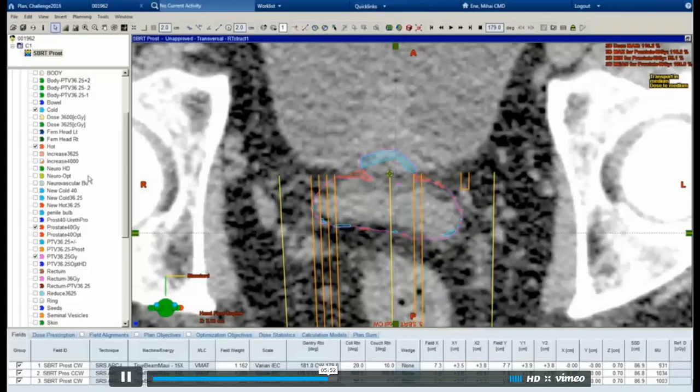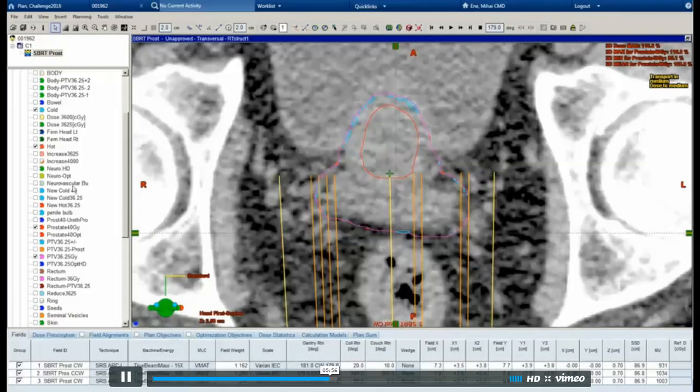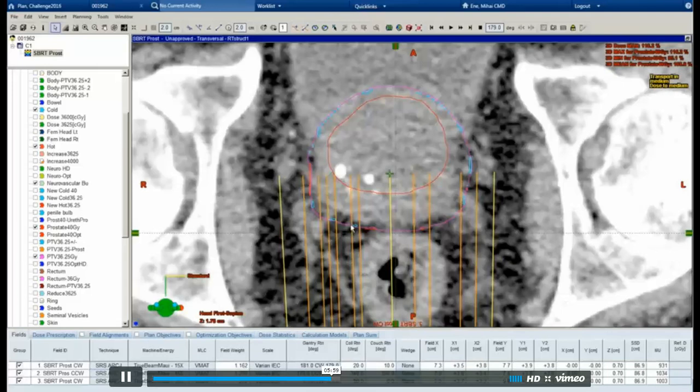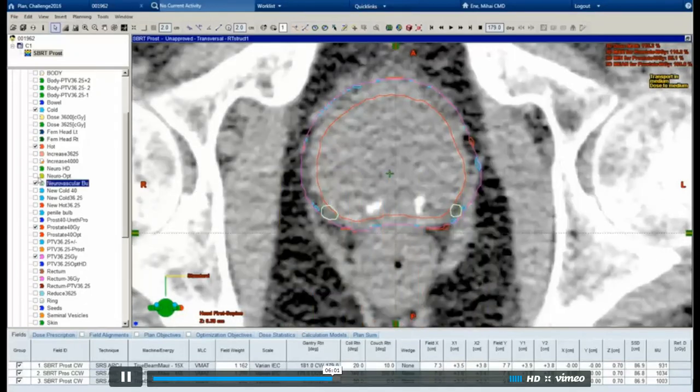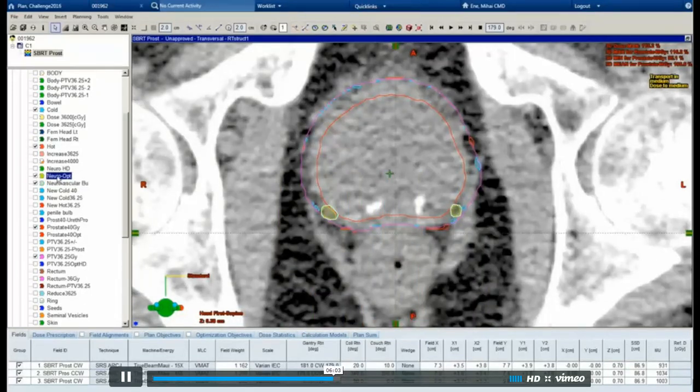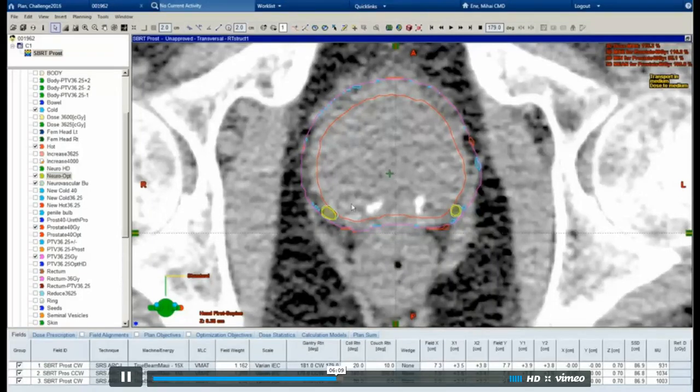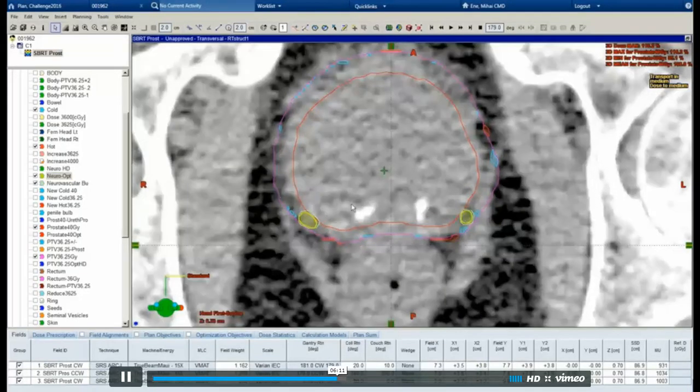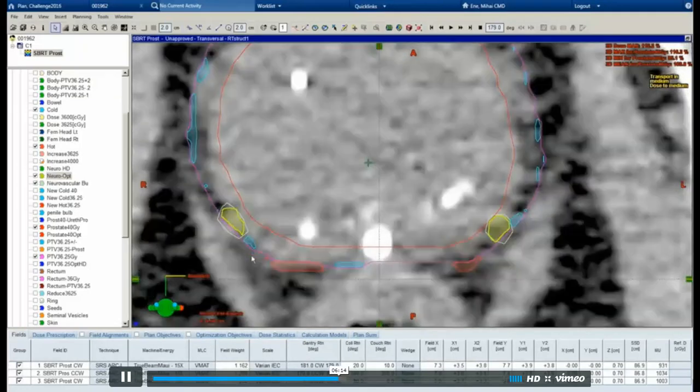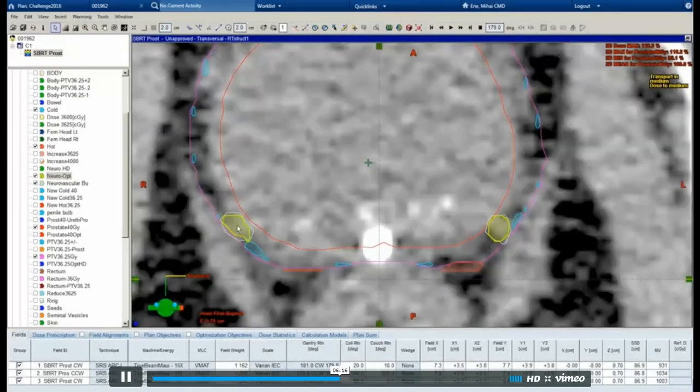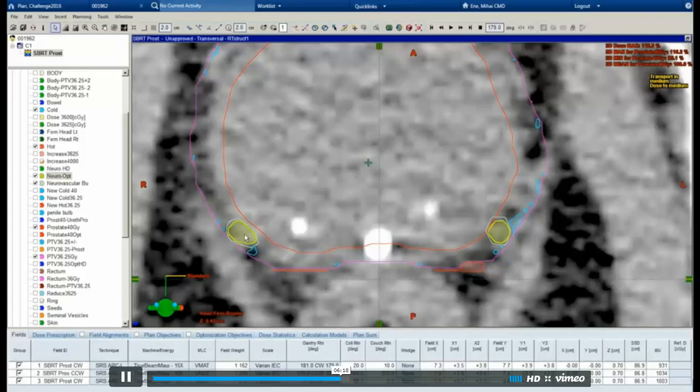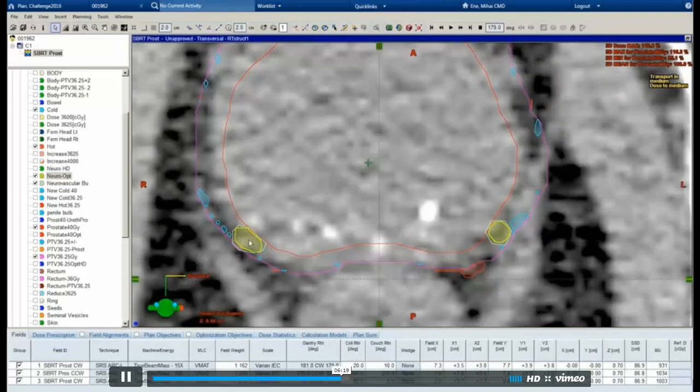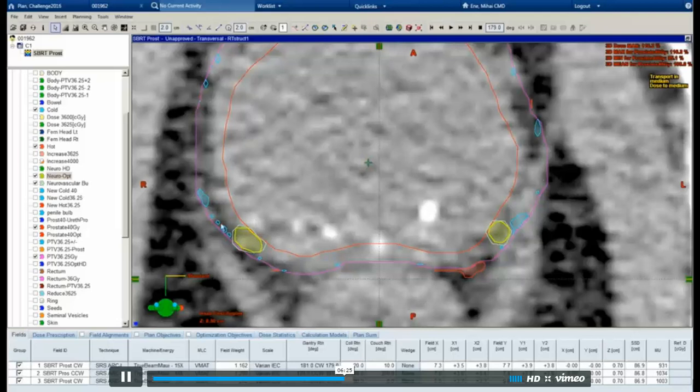Another thing I did was I noticed that in trying to spare the neurovascular bundles, I was losing coverage around them. And so I created these small neurovascular bundles optimization structures, which are almost identical to the actual neurovascular bundles, but they don't stick out of the PTV and they aren't contained within the actual neurovascular bundles.